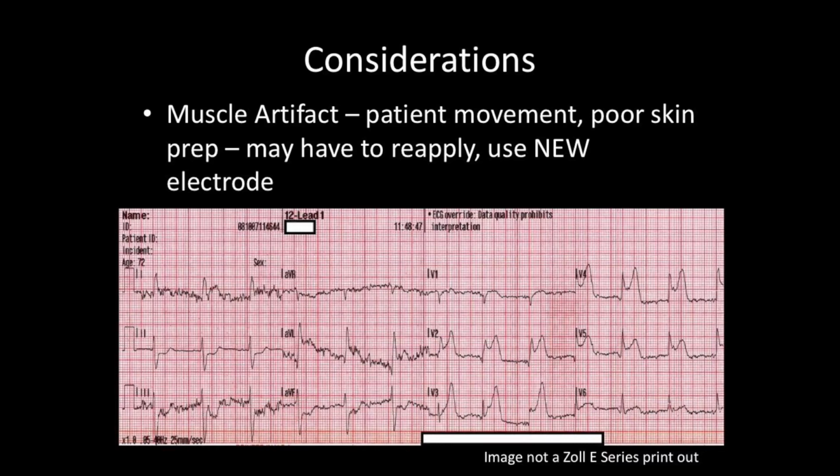So if Charlotte doesn't have things set up, if Charlotte is not ready to deal with it, whatever, again, not my issue, their issue. We're going to do the best that Winsted Ambulance can do for the patient. I just want you to send that EKG, even if that's the best. You can try another time, and if you can't get a better one, that's okay.